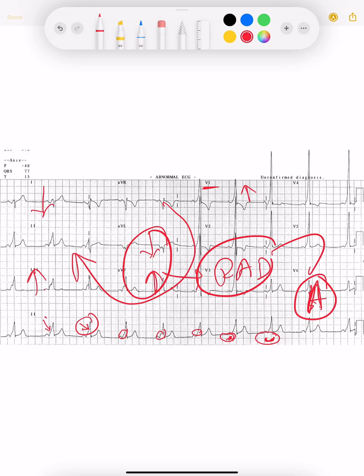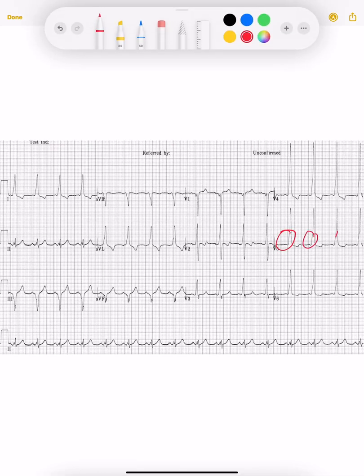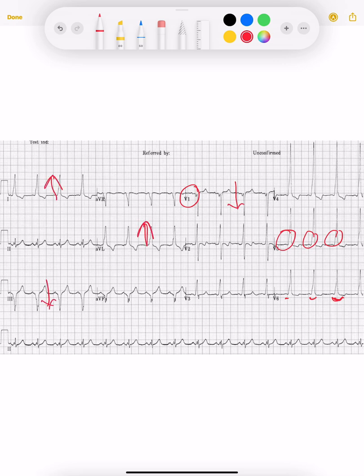Let's see another example. We can see some upslurring — a delta wave — the PR interval is very shortened, and QRS is prolonged, so this is WPW syndrome. Which type? Look at V1 — V1 is negative, so this is Type B WPW syndrome. Moreover, looking at the axis — Lead I and Lead III are pointing away from each other — there is left axis deviation. This confirms Type B WPW syndrome.